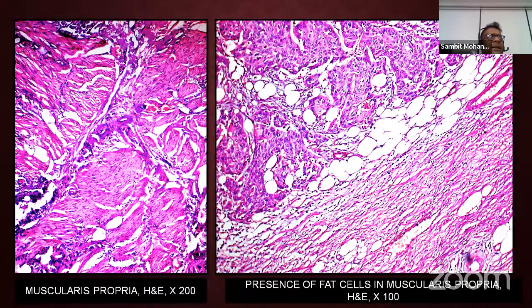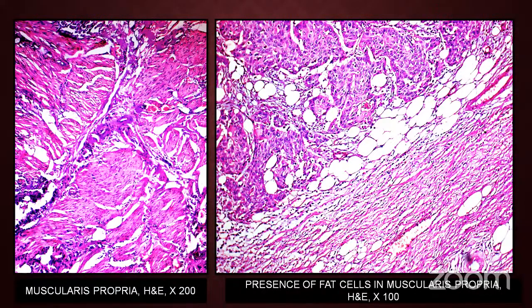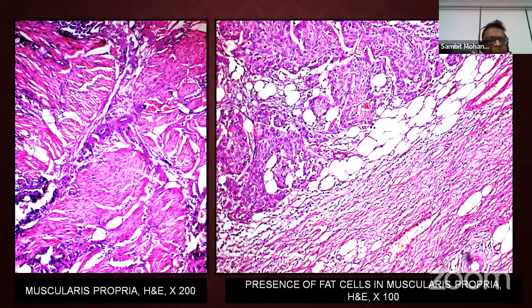What you write in the comment: the tumor is extensive and is high grade in histology, infiltrating the bladder wall with presence of abundant adipocytes, signifying muscularis propria invasion. However, typical detrusor muscle bundle is not identified. Therefore, cystoscopic imaging and clinical evaluation is necessary for further management, because MRI is a very good tool for them to find out, or this will call for a repeat TURBT of the base to see the muscle invasion.